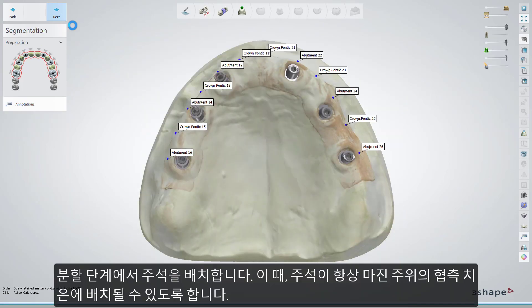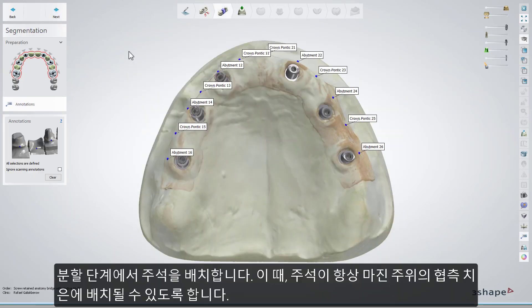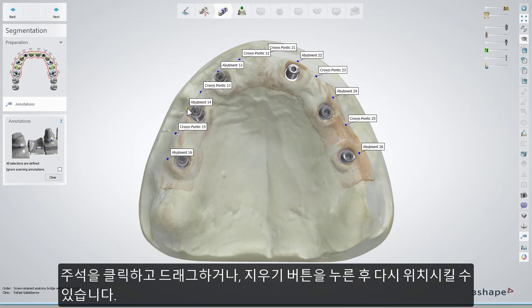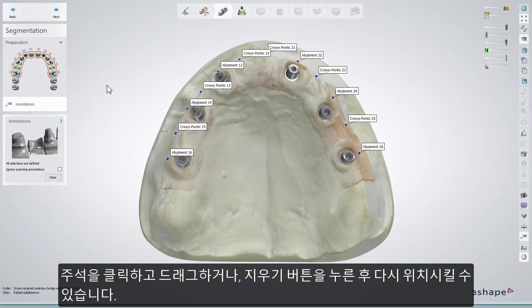In the segmentation step, place the annotations, keeping in mind that they should always be placed on the buccal side of the gum near the margin. If an annotation has been placed during the scanning, you can always move it — just click and drag, or select the Clear button and place it again.